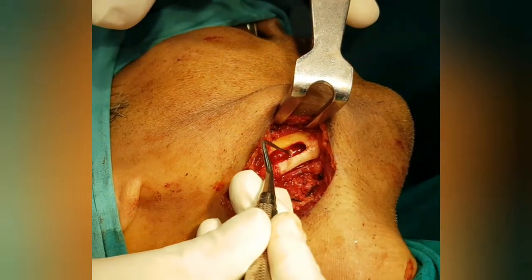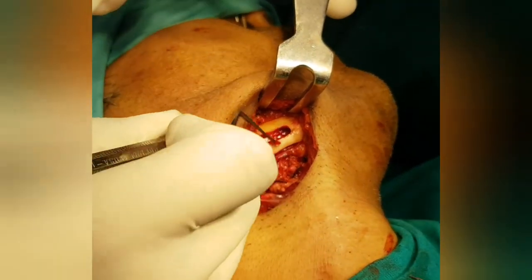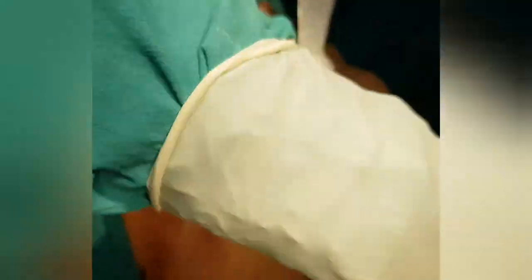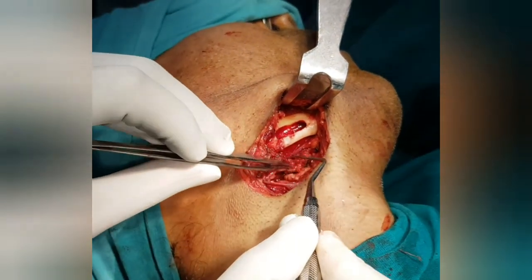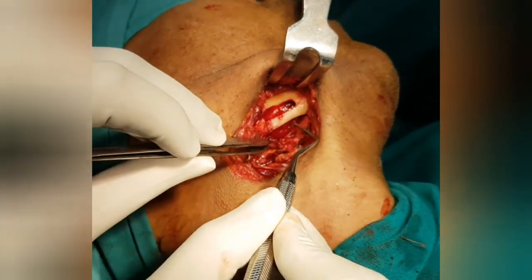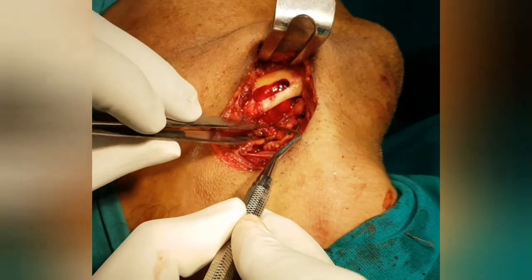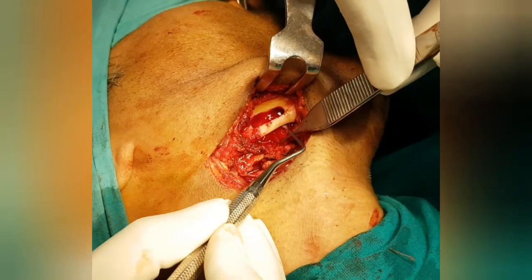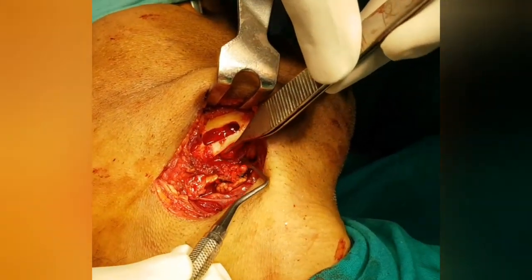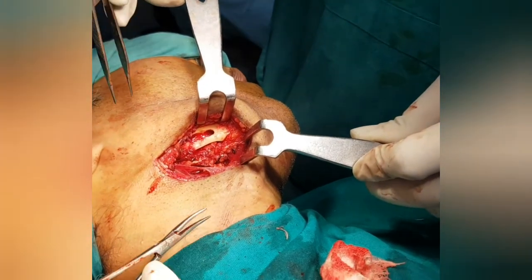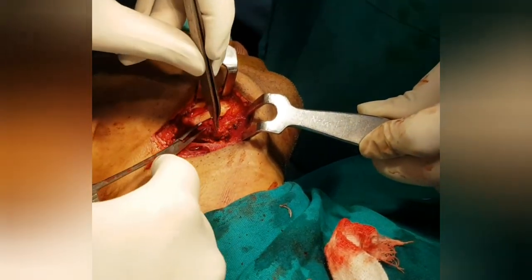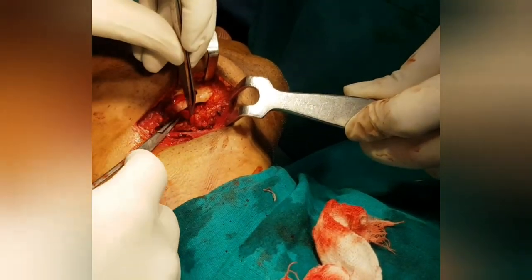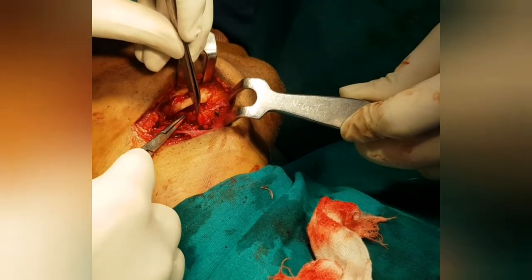I freed the tumor from all the superior, posterior, as well as the inferior border of the mandible. Since there is no lingual cortex, I removed the tumor from this side. Look at this — this is the tumor that was inside the body of the mandible, and we'll remove it.